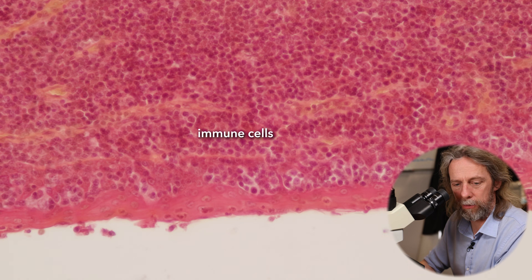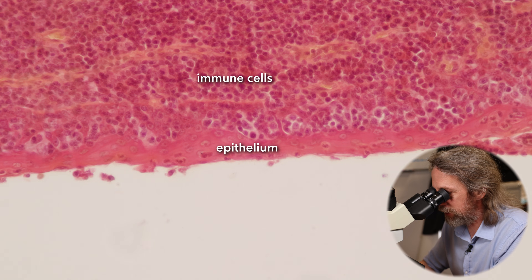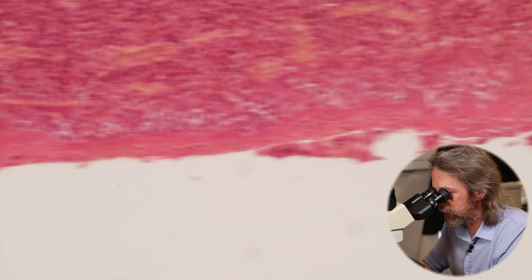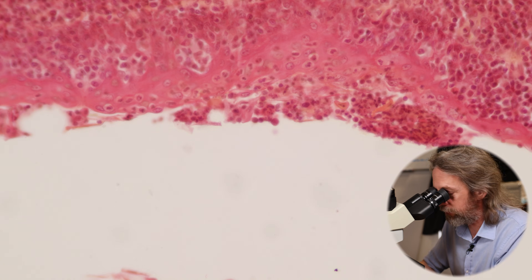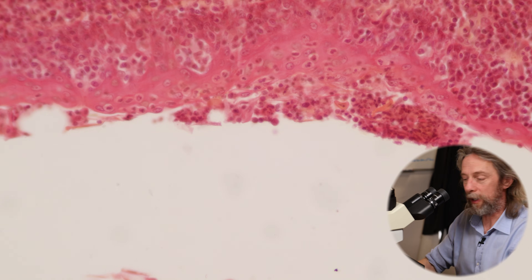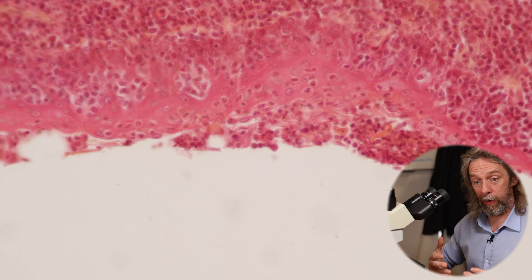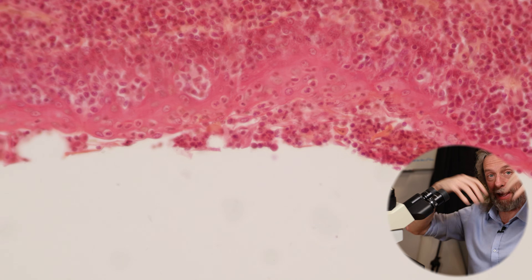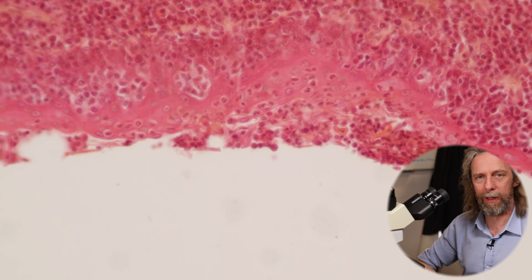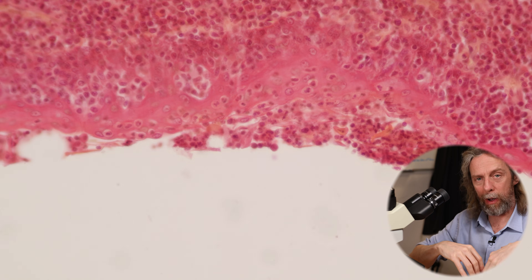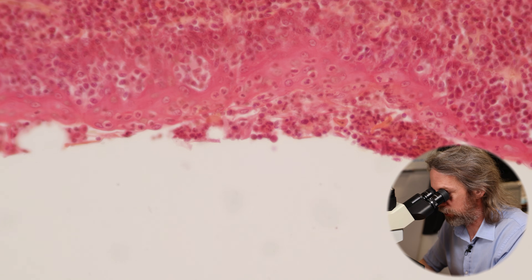We've got immune cells on one side, and that epithelium looks pretty thin — it has been infiltrated by lymphocytes — and then in the lumen there we're seeing debris. That's the tonsil doing its job. Those tonsillar crypts are great because they give more surface area, letting debris and pathogens from the oral cavity and nasal cavity get deep into the tonsil where the lymphocytes can fight the infection.